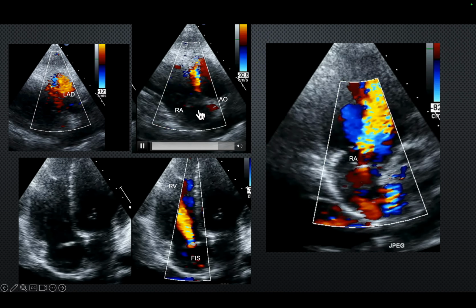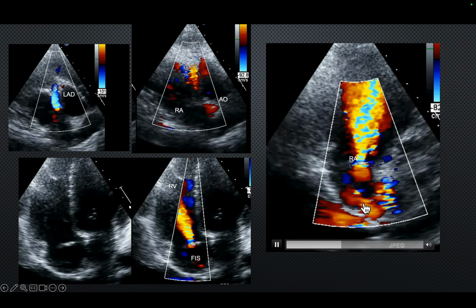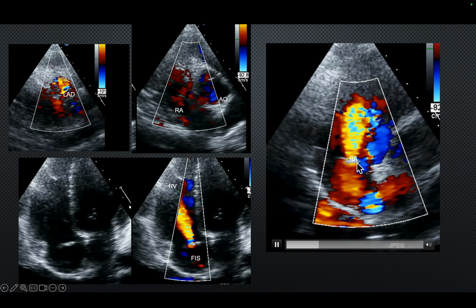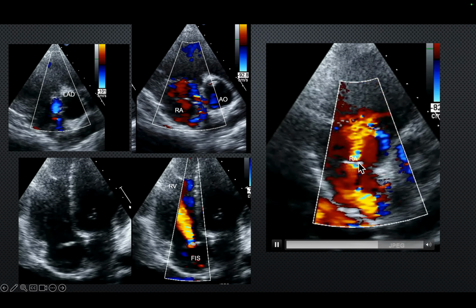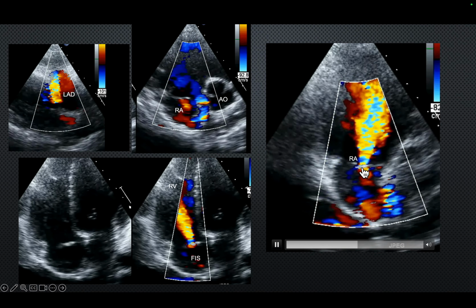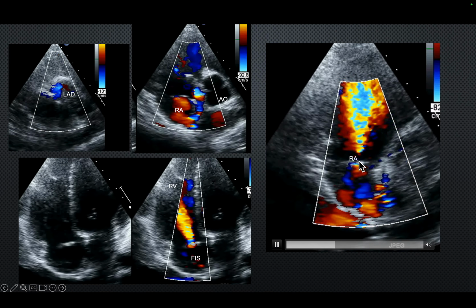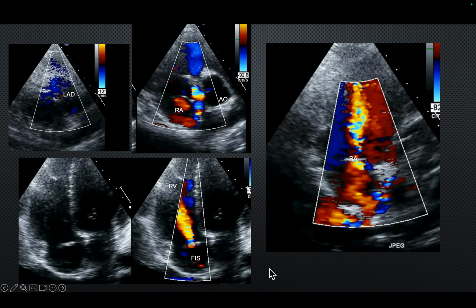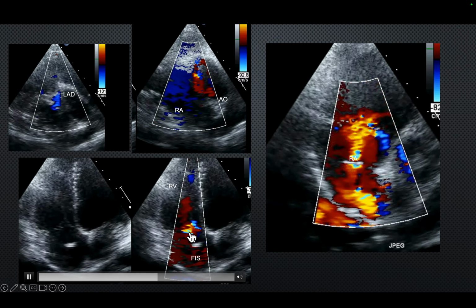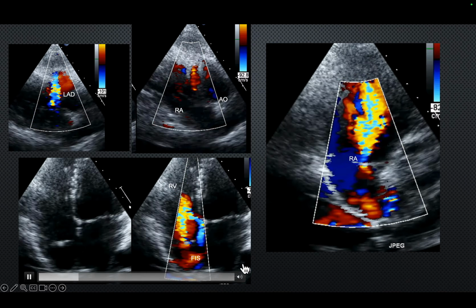We actually follow the coronary artery or a fistula till we see the entry point. So that's an entry point into a kind of an aneurysm, and then this aneurysm has a restriction and opening into the right atrium. Because of this restriction here in the entry point of the coronary fistula, there is a dilatation of this aneurysm formation in the right atrium, and that's where you saw this fistula, and this is entering into the right atrium, and it's having a continuous flow because of the obstruction here.